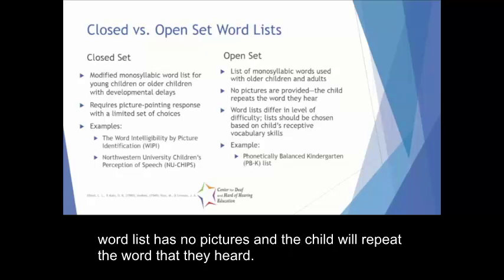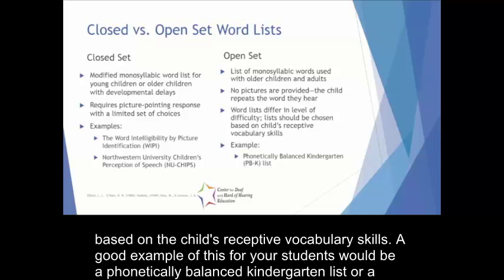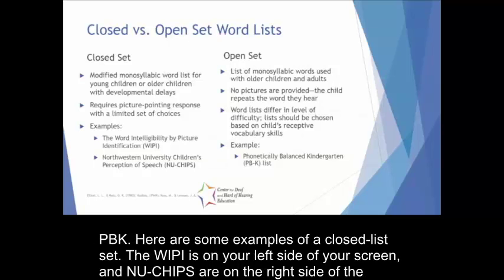An open set word list has no pictures, and the child will repeat the word that they heard. This is a list of monosyllabic words used with older children and adults. The words may differ in their level of difficulty, and a list should be chosen based on the child's receptive vocabulary skills. A good example of this for your students would be a phonetically balanced kindergarten list, or a PBK.